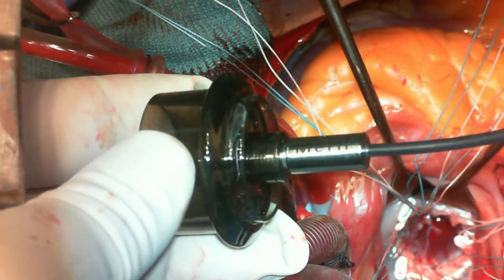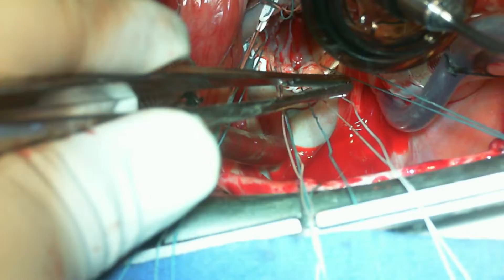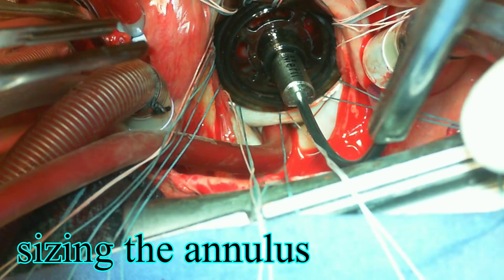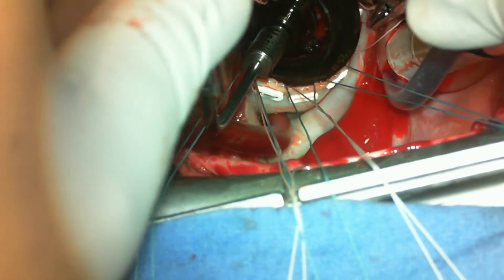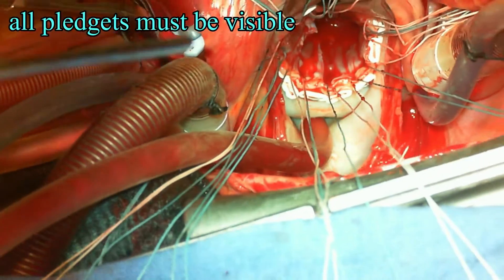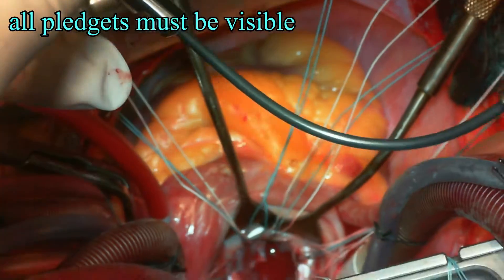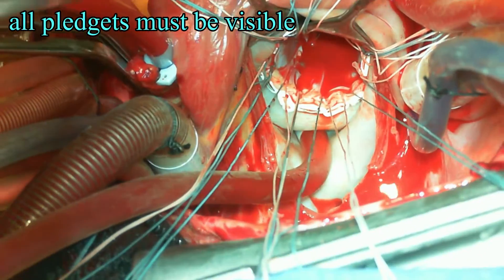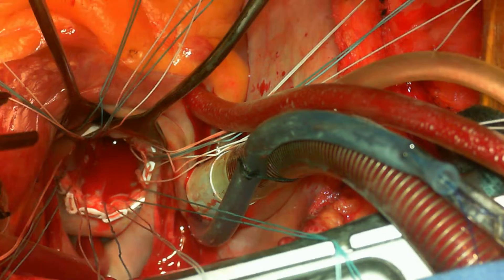This is the obturator provided by the Merrill manufacturers. I have no conflict of interest with this product, but it was quite user-friendly — quite smooth, and you could bend it multiple times so it could conform to the shape you want in the handle. We sized the mitral annulus: the basic idea is that the obturator should get in gently and should be able to come out gently from the annulus. You should be able to see all the pledgets outside of the obturator and should not be pushing it hard into the annulus.